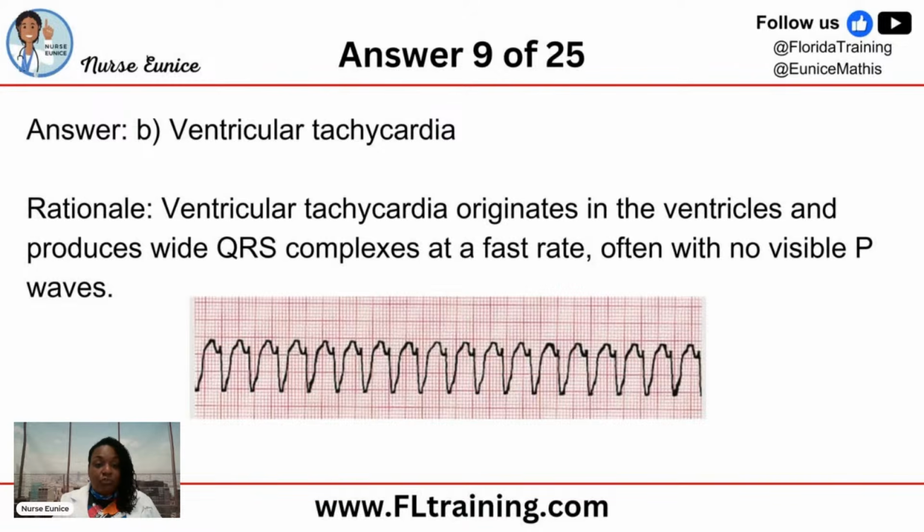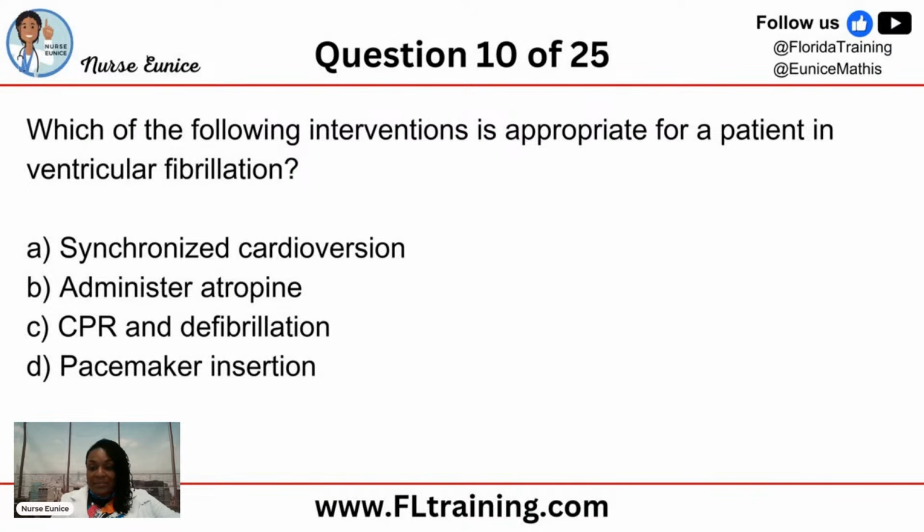Remember, we don't treat monitors, we treat people. So when you see this, go and look at your patient. Okay. Any questions about ventricular tachycardia?